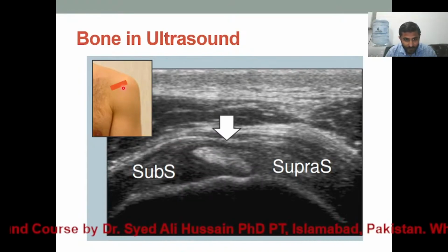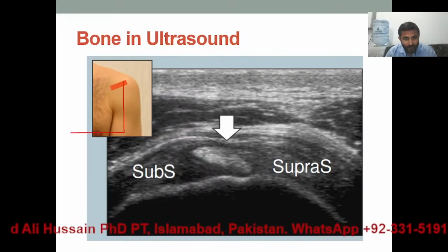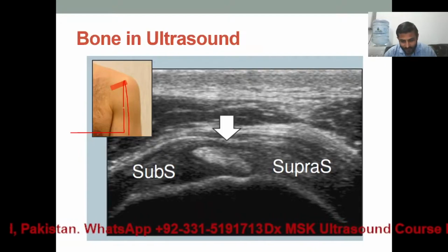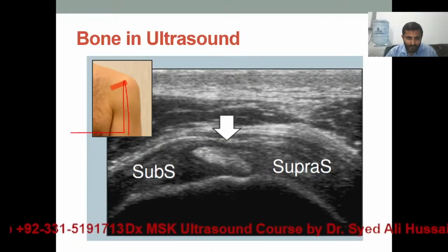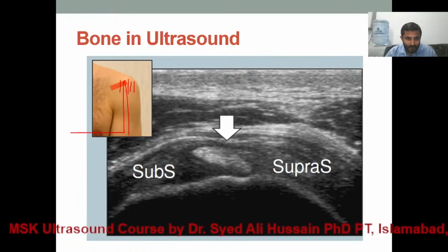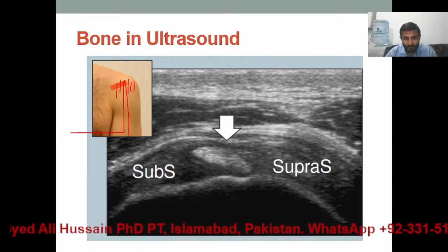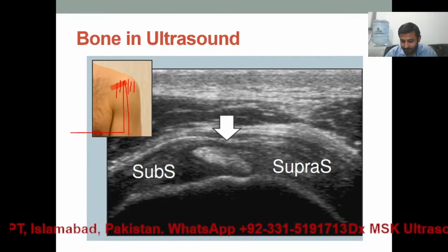If we see the bicep, the bicep is like running from here to here. Now tell me if it is long axis or short axis to the bicep. No, the deltoid fibers are again like this. So for the deltoid also, it is short axis. Yes, for pecs it's long axis, only for the pectorals.